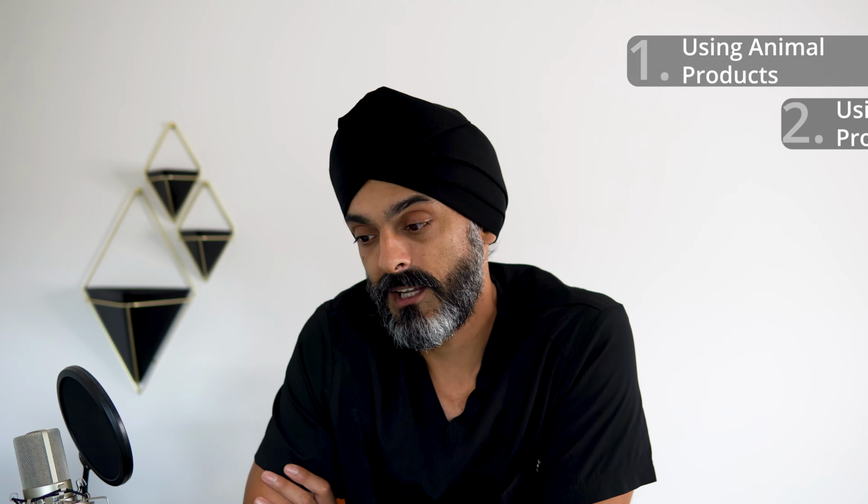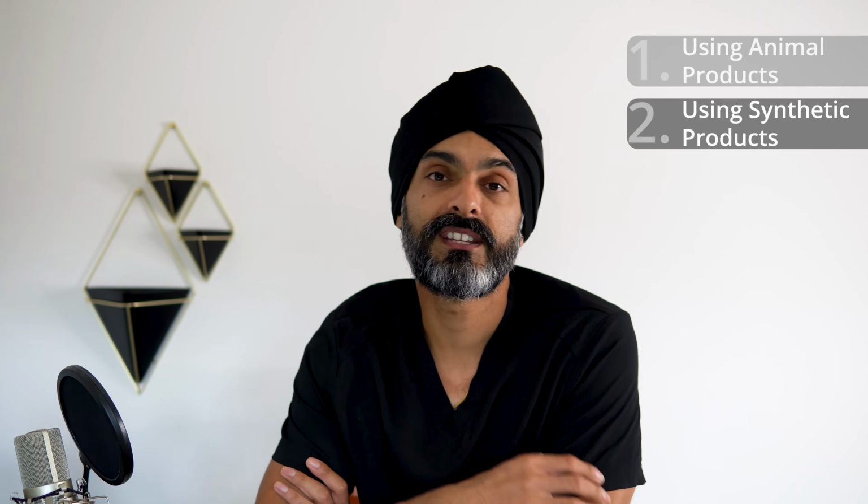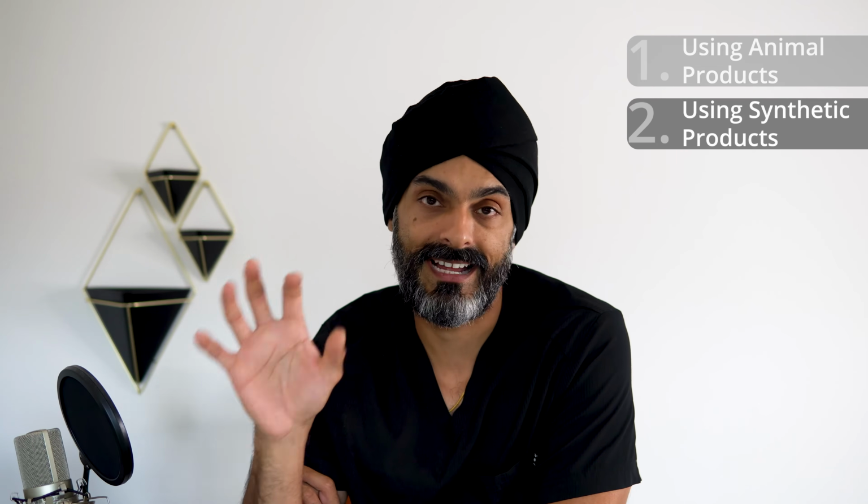Now, the second type of bone grafting is similar in principle, but we can use completely non-animal products.